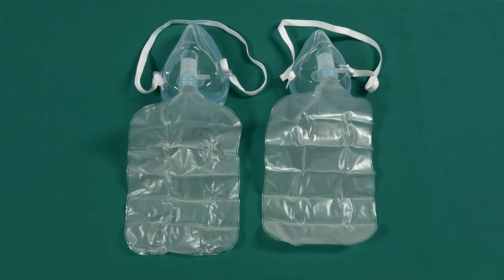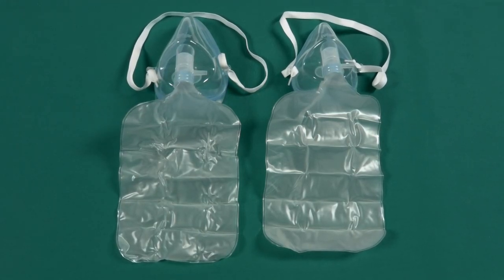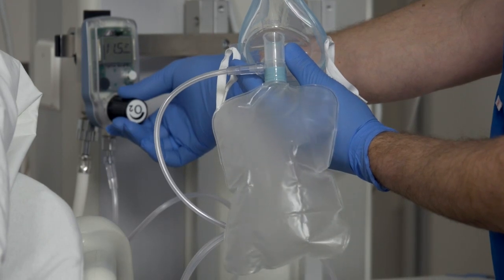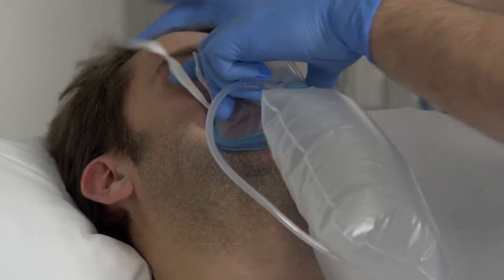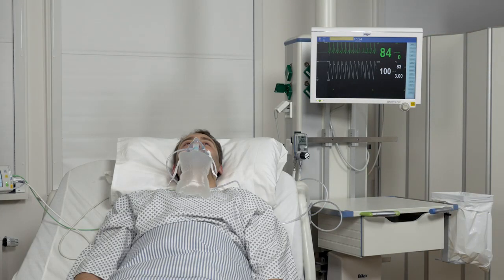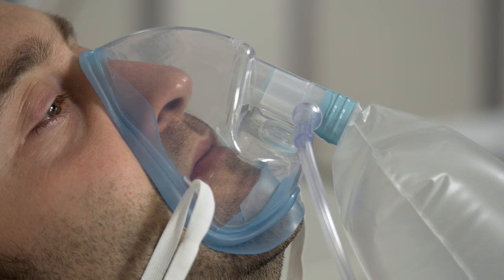In contrast to the nasal cannula or the medium concentration oxygen mask, the non-rebreather mask allows supply with oxygen concentrations greater than 80 percent. Before putting on the non-rebreather mask, the bag must be filled with oxygen. The patient breathes air from the bag and then out via the exhalation valves on the mask. The mask must have a tight seal with the face. The mask is fitted with an anti-suffocation valve, a safety valve that opens in case the bag is empty. If there is no oxygen supply, the mask must be removed.